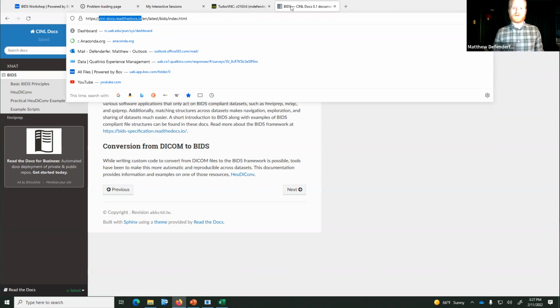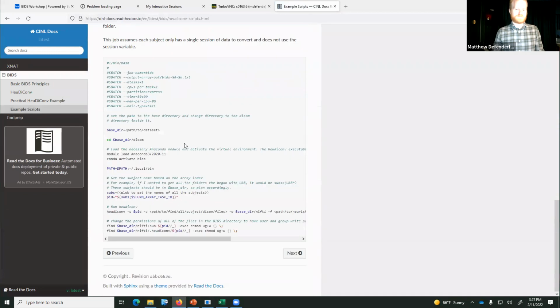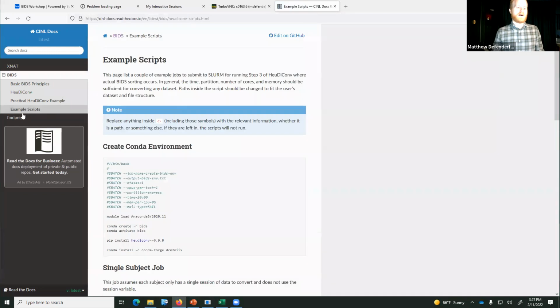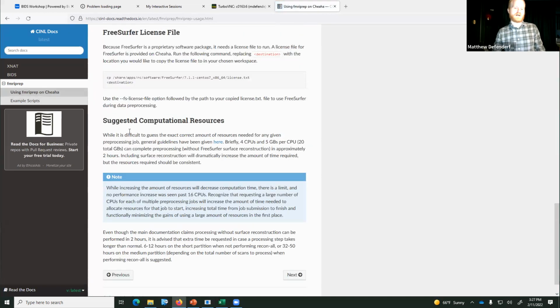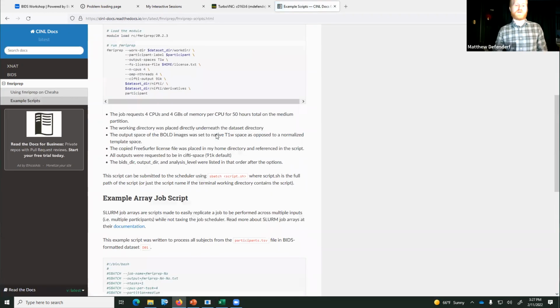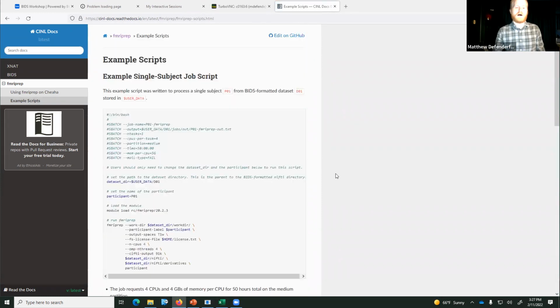So let me bring up the chat real quick and put it in here. It's got information on XNAT, BIDS, BIDS conversions, as well as example scripts that I've written up. And fMRIPrep, like what it is, how to use it on the cluster, and the example scripts that I've written up for that as well. If you all want to go there and look at that information, that could also be helpful.